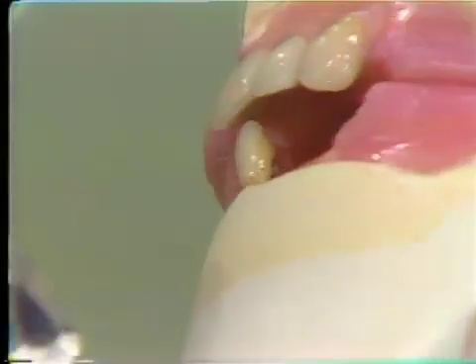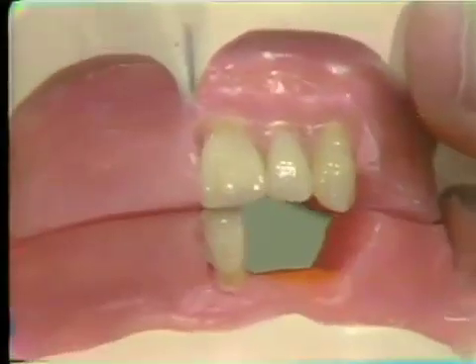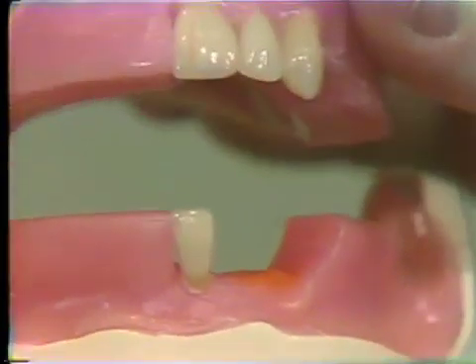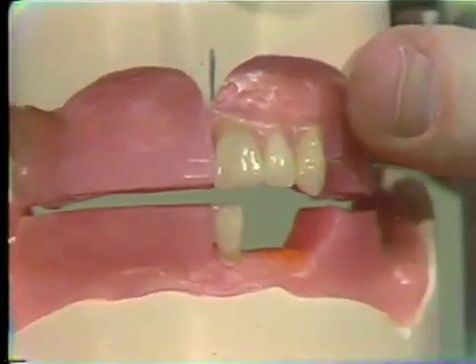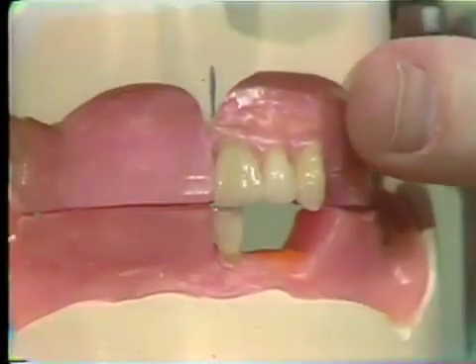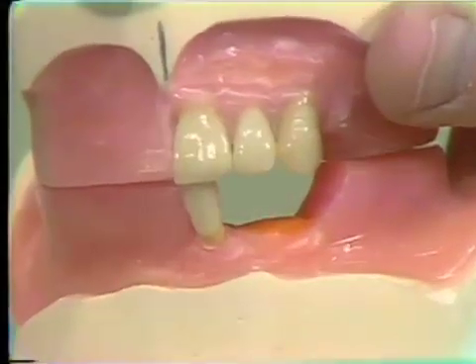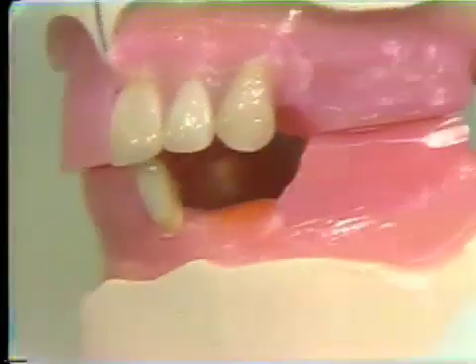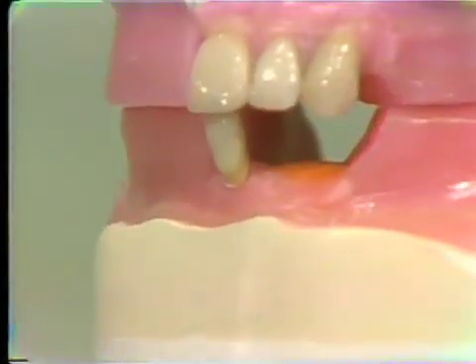We do not lock anterior teeth in the denture. They do not contact in a denture. Now looking straight in like this, you can see that because the lower incisal edge of this anterior tooth is even with the occlusal plane, and the maxillary central was set a millimeter below, this generates our arbitrary 1 millimeter vertical overlap or overbite. So these are the criteria for setting the lower anterior teeth.